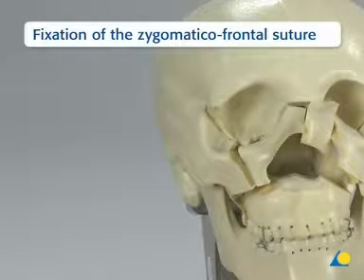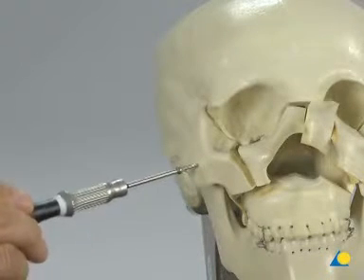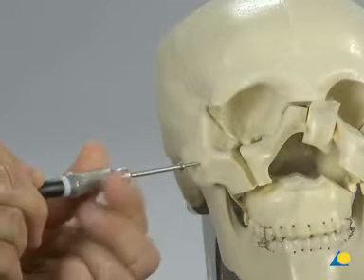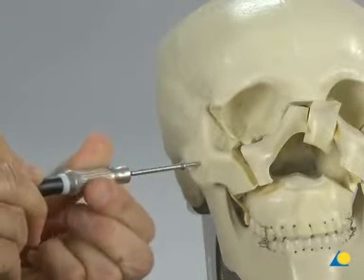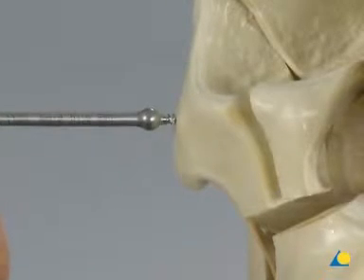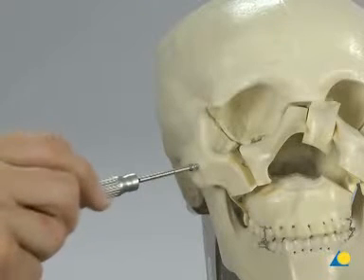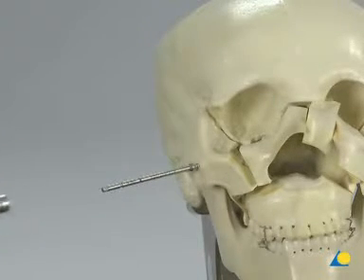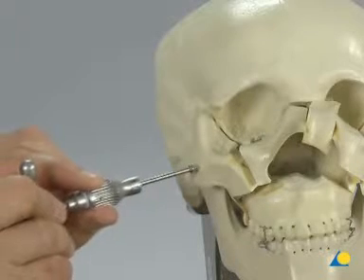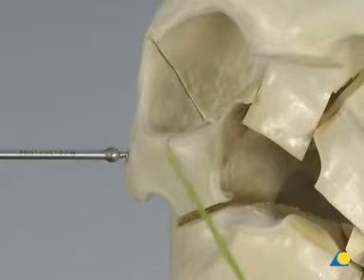In the clinical situation, the reduction of the zygomatico-maxillary complex fracture is begun by inserting the self-drilling 2.4 mm threaded reduction tool with the screwdriver handle through a stab incision in the skin into the dense bone of the malar eminence. This reduction tool is positioned so that it does not interfere with the areas that will be plated and should not be fully inserted. The screwdriver handle is disengaged by pulling back on the sleeve, and the T-handle is mounted by pushing the sleeve forward until fully engaged.